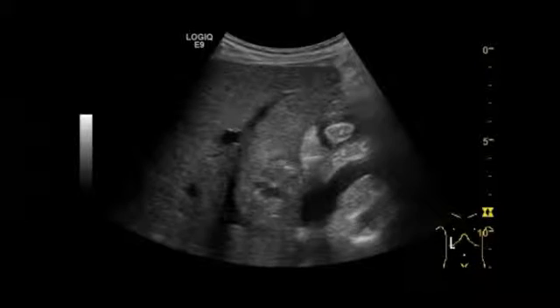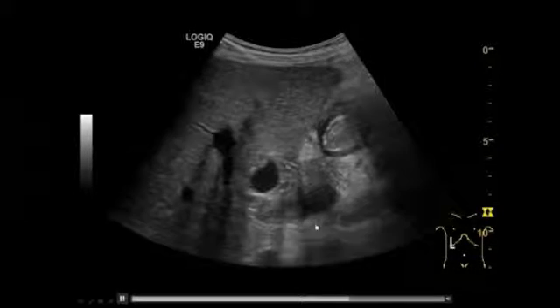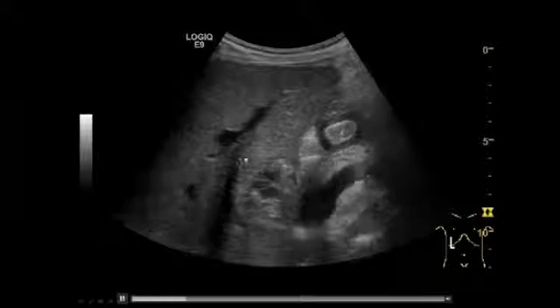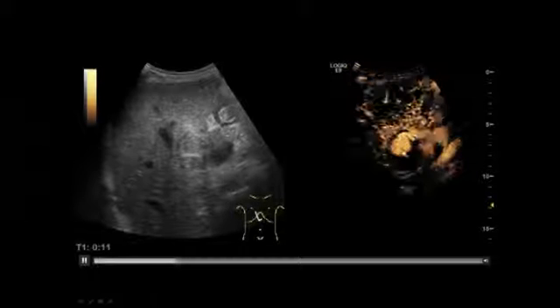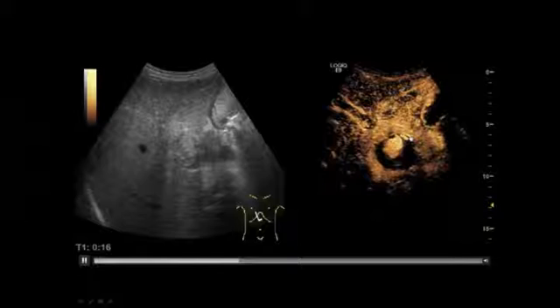This is another child who received a full liver transplant. He had Alagille syndrome, and he had 2 liver arteries, and one of them developed a pseudoaneurysm, and you can see here that there's a little vessel going into it, and when you inject contrast, you see here the hepatic artery, and you see that this pseudoaneurysm is half thrombosed already.